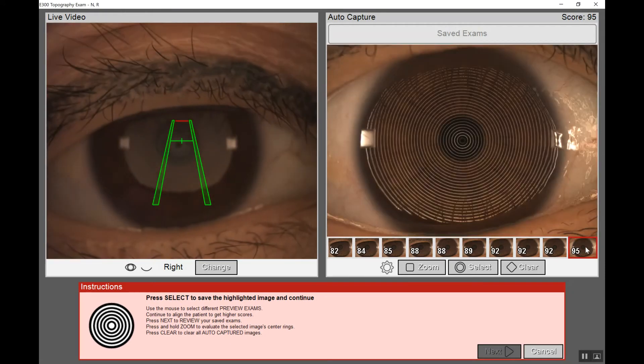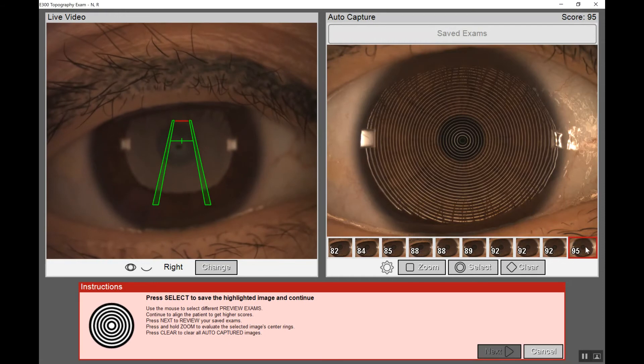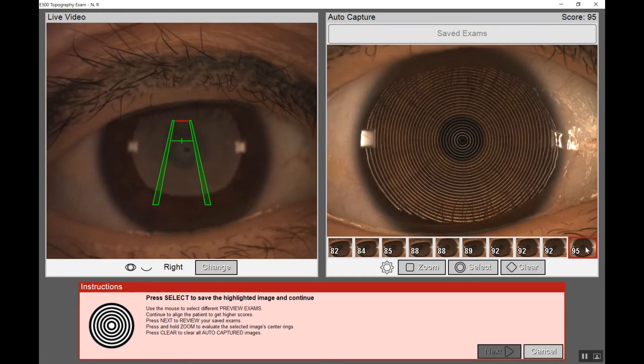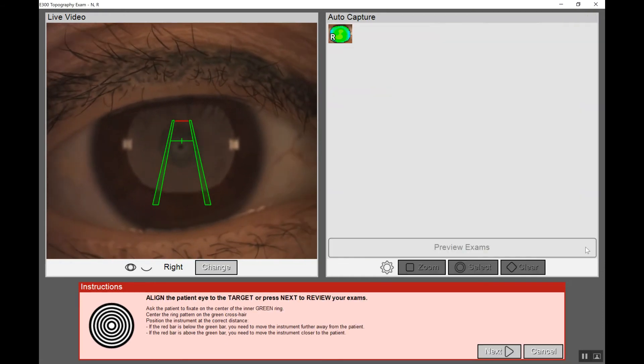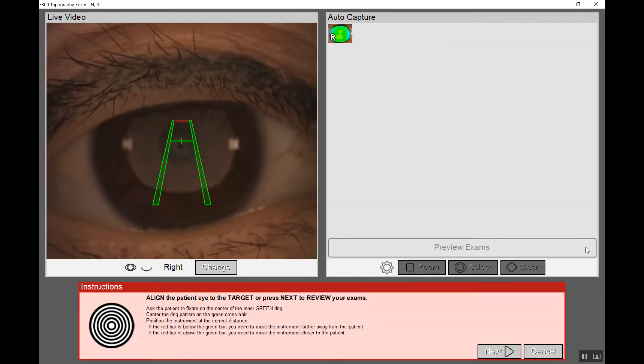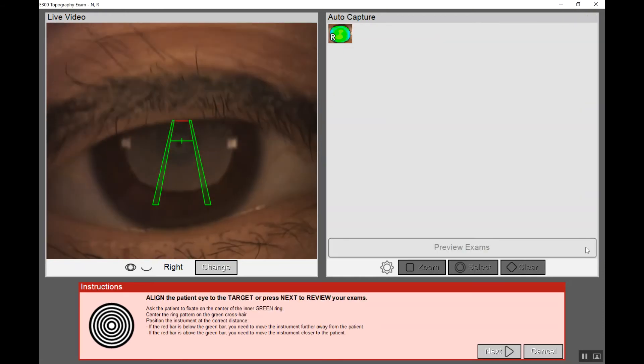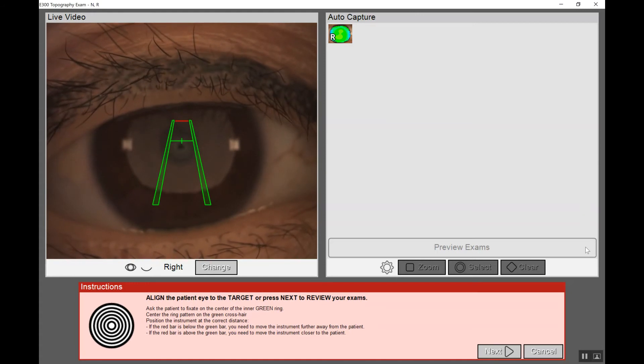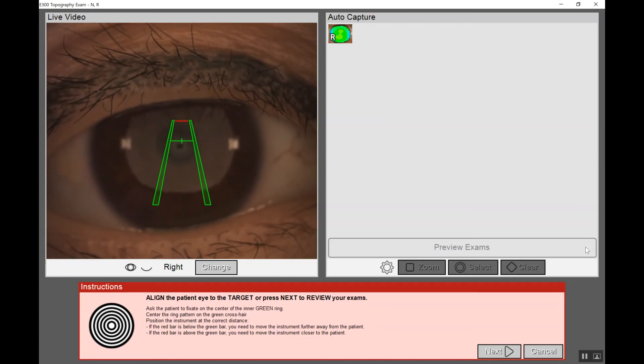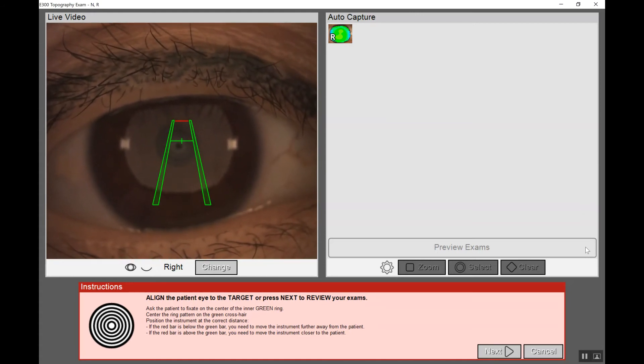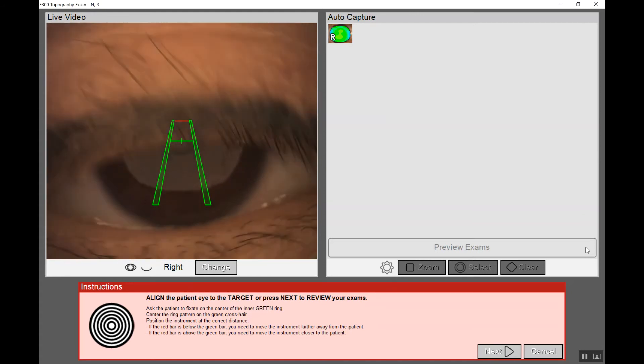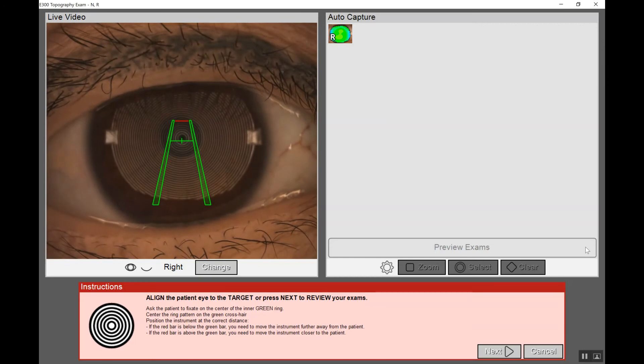If we're happy with the capture, we can click select and that will suspend that image in order for us to take additional captures before we're ready to save all of the captured images.